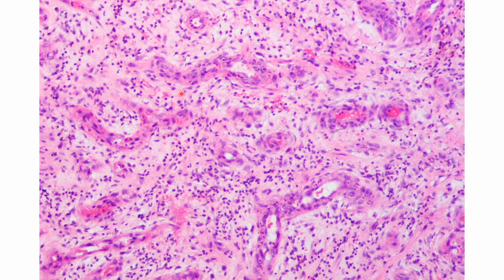And last one is on granulation tissue. Don't confuse granulation tissue with granuloma. This is granulation tissue, part of the healing process. Basically, in the healing process, because it needs a lot of nutrients, one of the most prominent features is a lot of new growth of blood vessels. So these are blood vessels, these are newly grown blood vessels.